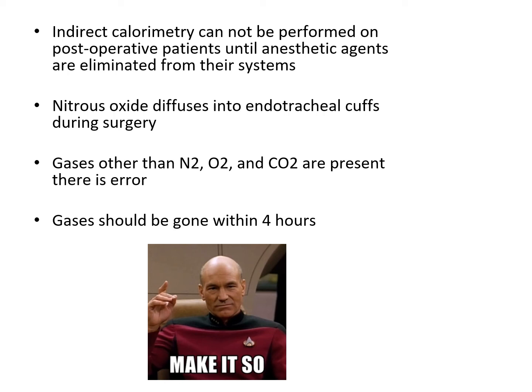Other things to keep in mind, this cannot be performed on post-op patients until the anesthetic gases are eliminated from their systems. Nitrous oxide actually can diffuse into the endotracheal cuffs. Other gases other than N2, O2 and CO2 are present, and there is an error. And these gases should hopefully be eliminated within 4 hours.